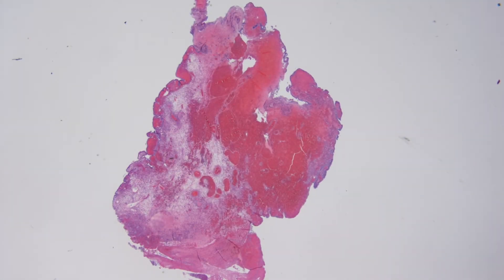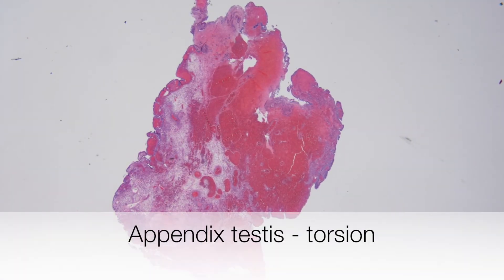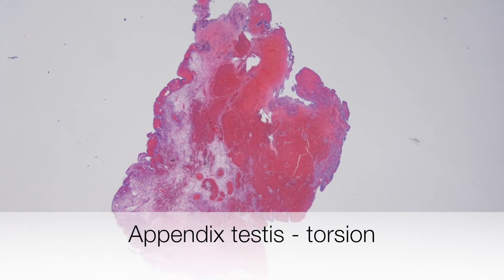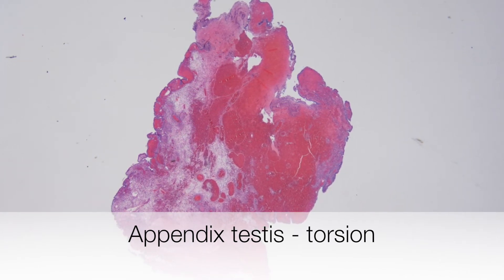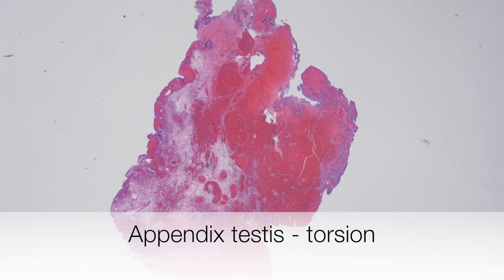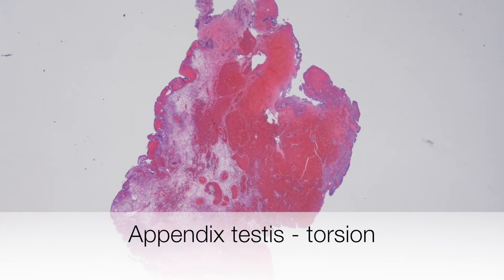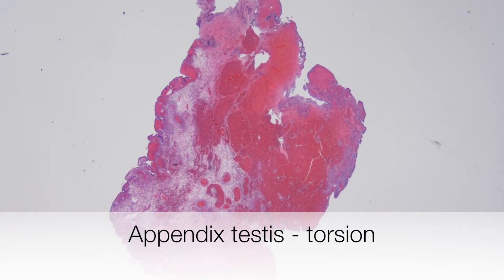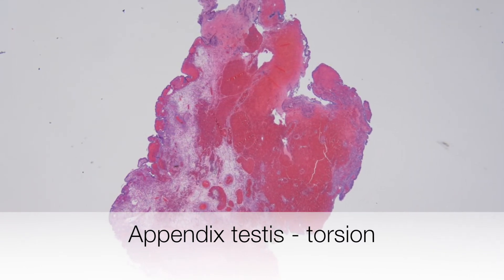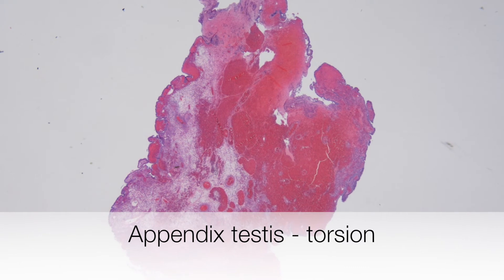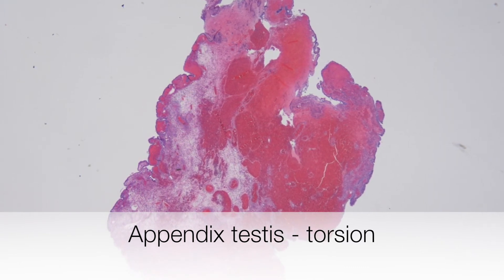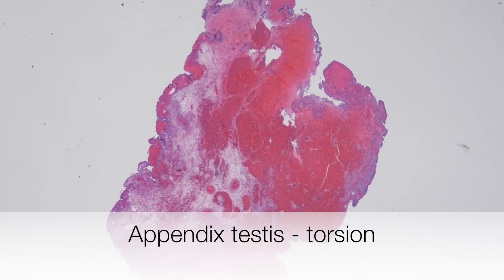This is a low-power view of a torted appendix testis. If the stalk of the appendix testis is narrow, it will be susceptible to being twisted, resulting in haemorrhagic infarction.